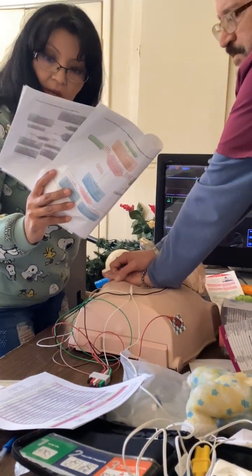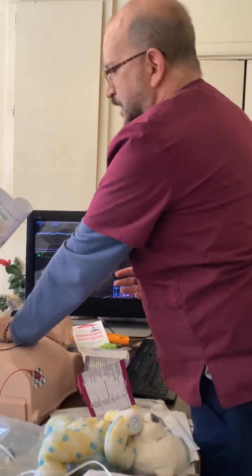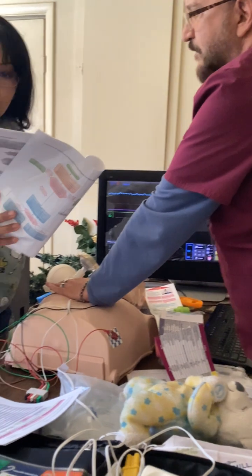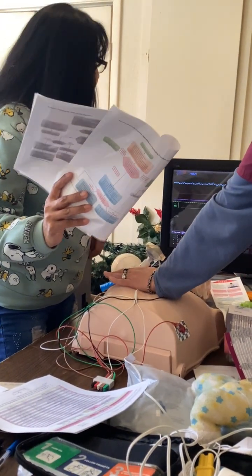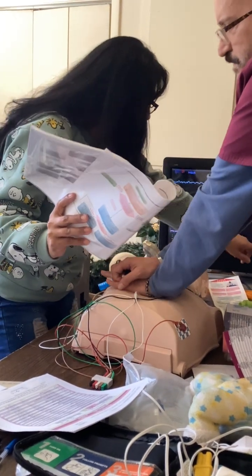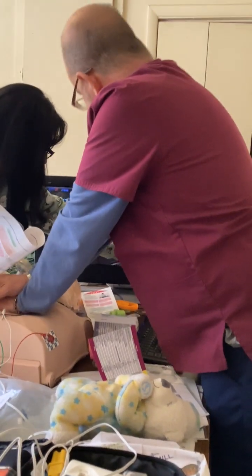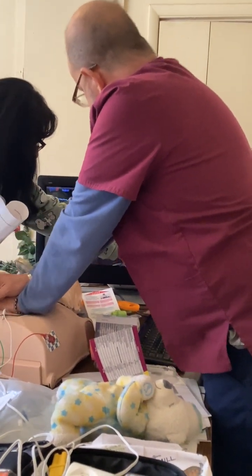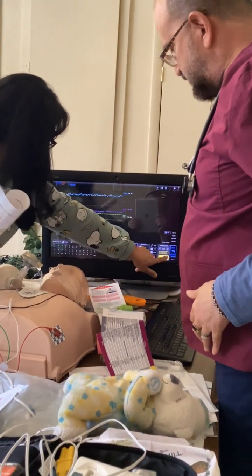Okay. So it's been 2 minutes. Any change? No change. Now it goes up to how many joules per kilogram? Second is 4 joules per kilo. It's 10 kilos times 4. 40? Yeah, you may not get 40 on there, so you might have to select 50. Oh, you did get 40. I'm gonna charge. Clear. Everybody clear?